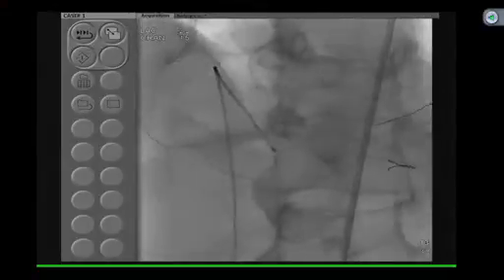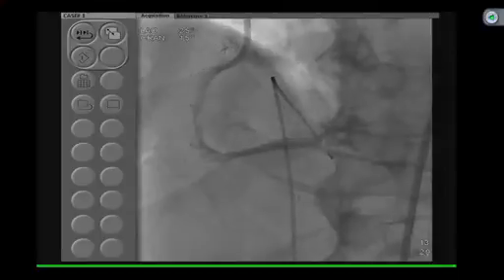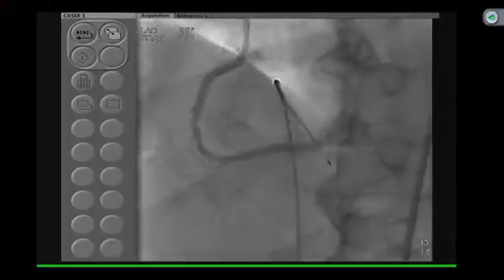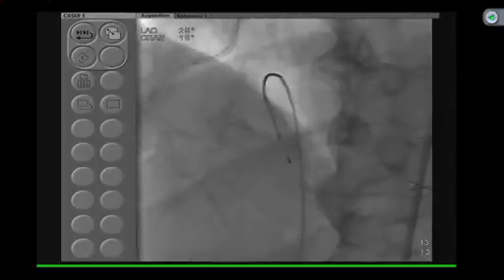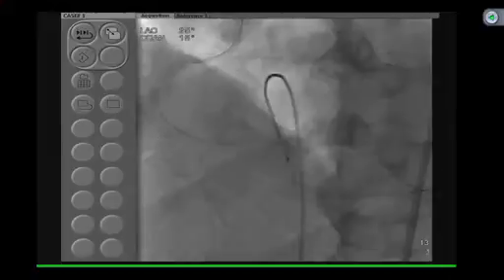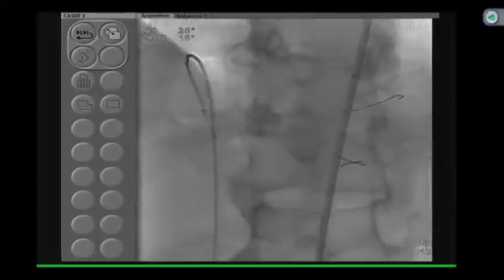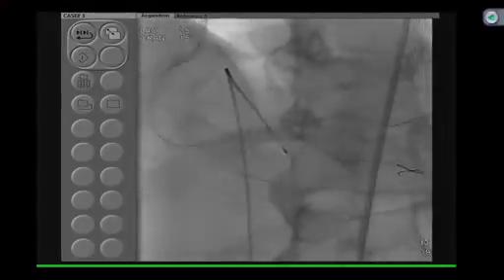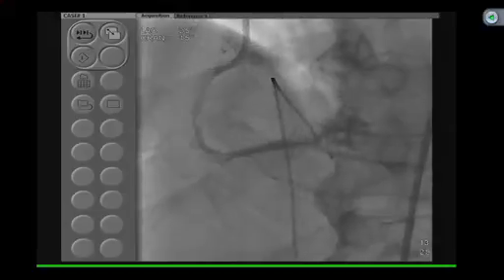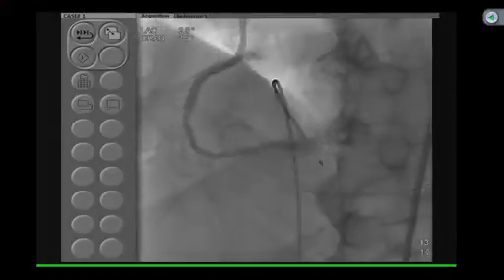We can just put a stent directly. Are you happy at the bifurcation, how it looks? Bifurcation looks very good. One of the interesting points that we have to make is when we are doing this bifurcation intervention, kissing balloon, we have to pay attention to the distal vessel, to which part of it the wire is in. Many times, when you are doing these multiple movements, the wire could have gone into a small branch, and then if you dilate the vessel thinking of the proximal area, you may end up with a perforation since the balloon is now opening into a small capillary. So it is very important when you are doing the distal vessel intervention to pay attention to where the tip of the wire is and where your balloon or the stent is going to be placed.